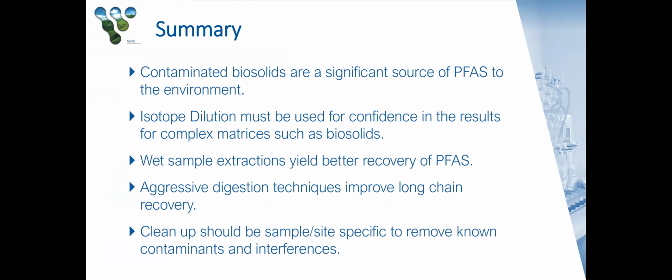Wet samples seem to offer better recoveries than an air-dried sample. And aggressive digestion techniques such as ion pair work a lot better than a simple methanol shakeout. On top of all this, cleanup should be used for all biosolid samples, and it should be sample specific. If you know there's likely to be high fats, you need to adapt your cleanup to remove those fat compounds.